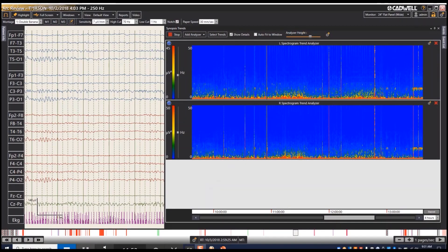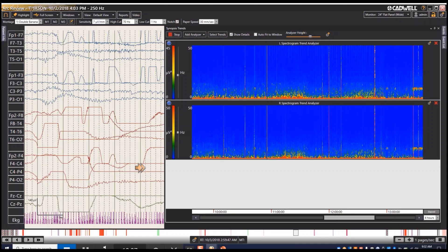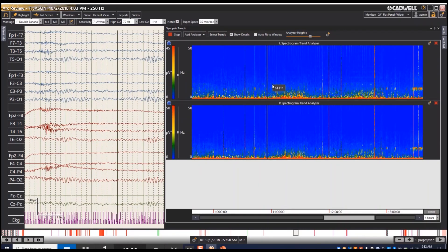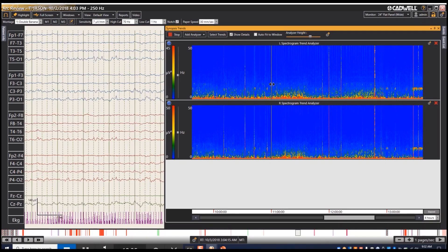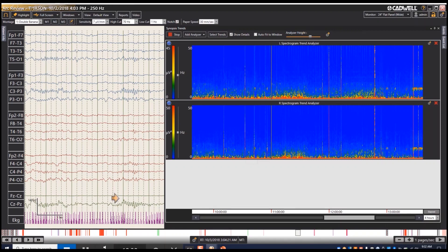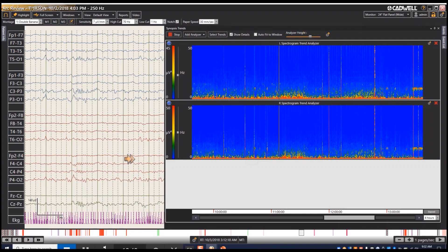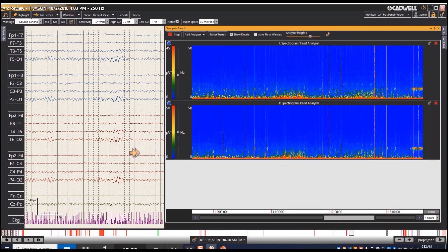This first example is a normal EEG — a 24-hour study, zeroed in on a four-hour segment. Where the cursor is, you can see a blip at about 9 to 10 hertz, which corresponds to alpha. As the alpha drops out, you can see that it's gone. Clicking further in, you can see a blip at 14 hertz, which corresponds to sleep spindles. You can very quickly identify where the patient is falling asleep by the sleep spindles, and where they're arousing by the alpha — giving you an easy way to review four hours of data and understand the patient's state.